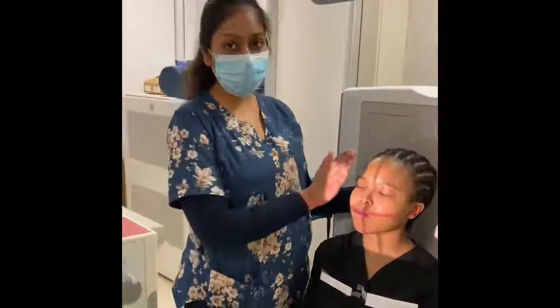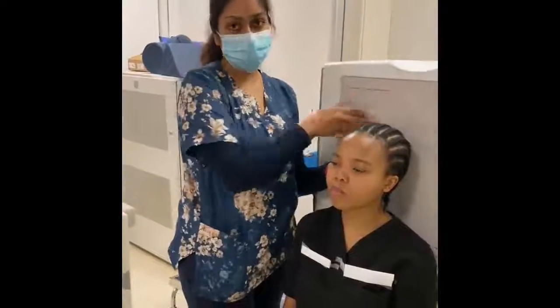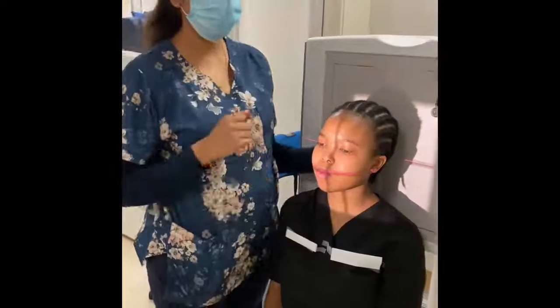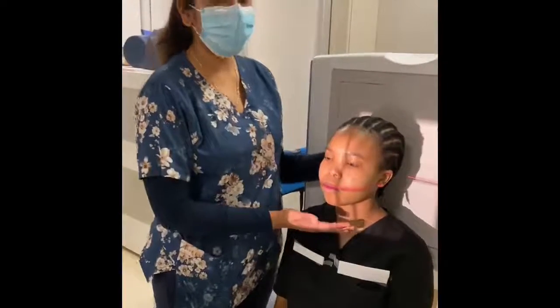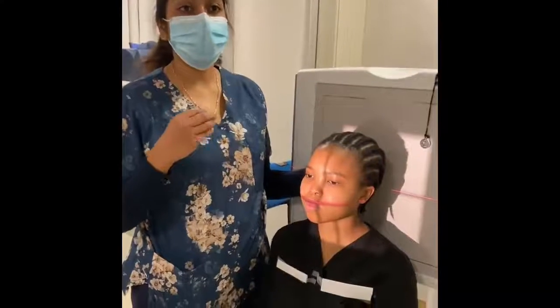So I'm going to try and position. Basically our patient is AP, so the beam is entering from the anterior aspect, exiting to the posterior aspect, or your frontal to occipital, so your FO applies here. What happens is we need to extend the patient's head and neck so that the IOML is actually parallel to your image receptor. It is very uncomfortable, so you need to be careful of how you do this position, as well as make sure that if it's a trauma patient, your patient does not have any C-spine injuries.